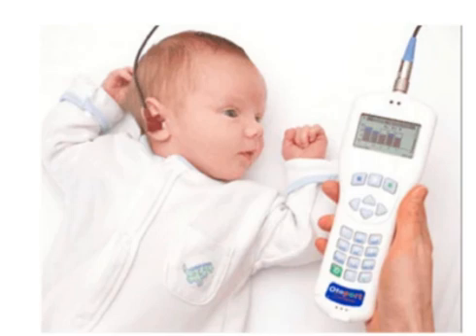Meniere disease. Meniere disease can elicit a unique OAE clinical presentation. In patients with Meniere disease who have hearing loss thresholds exceeding 30 decibels HL, OAE are expected to be absent. However, several studies show intact OAE in these patients. It is hypothesized that the outer hair cells were spared, and the poor hearing thresholds are due to inner hair cell dysfunction or a disruption in the afferent connections between the inner and outer hair cells.